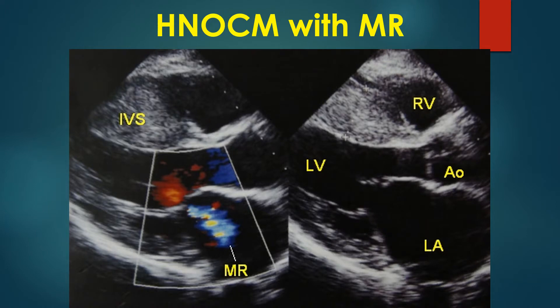A bluish mosaic colored jet of mitral regurgitation is seen in the left atrium during systole when the mitral valve is closed. Please note that there is no narrowing of the left ventricular outflow tract in systole. The flow in the LVOT is laminar without any mosaic pattern. There is no systolic anterior movement of the mitral leaflet, which is the most important cause of LVOT obstruction in hypertrophic cardiomyopathy.